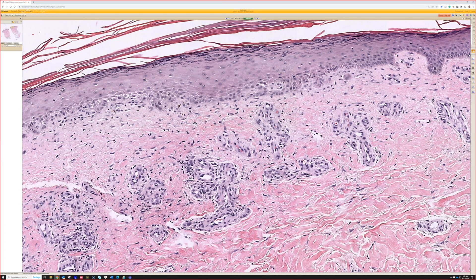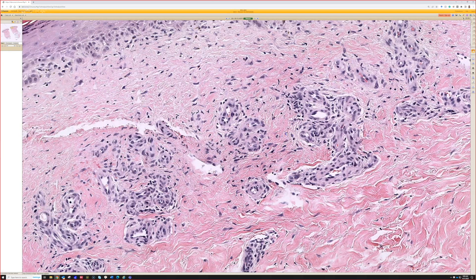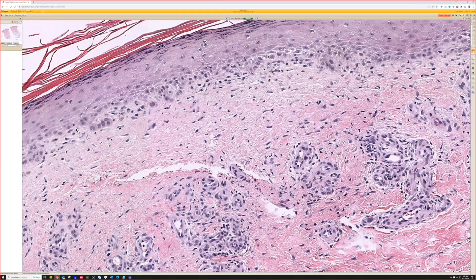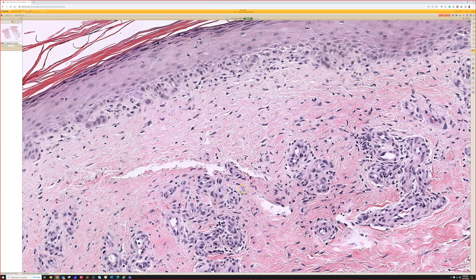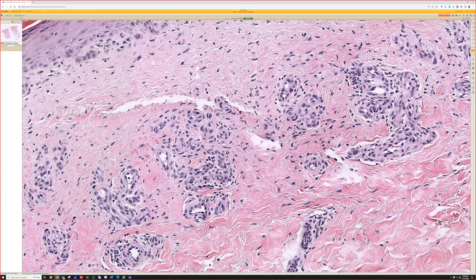The person is certainly an adult and potentially an older adult. You tend to get more stasis as you get older, just because gravity's had more time to fight against your blood vessels and make venous backflow pressure, which creates these little clusters and lobules of thick-walled capillaries, often with background fibrosis of the superficial dermis — sometimes with a lot of blood and hemosiderin, other times not as much.